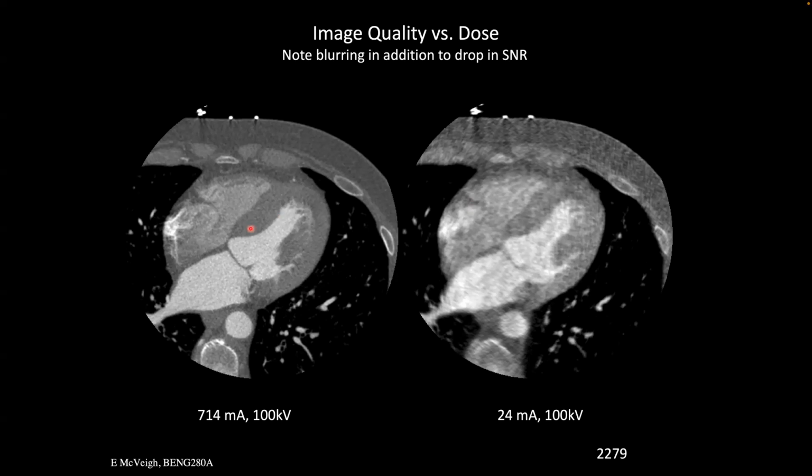You can get as many example cases and pictures as you want from the vendor. If you work with the vendor, they'll say, I want you to go visit this clinic. And usually with CT scanners, the clinic is like a mile away and they have a scanner there because there's so many of these things. So they say, just spend a day over there and you see 20, 30, 40 cases and see if you're comfortable with it, right? So that's one way of doing it.